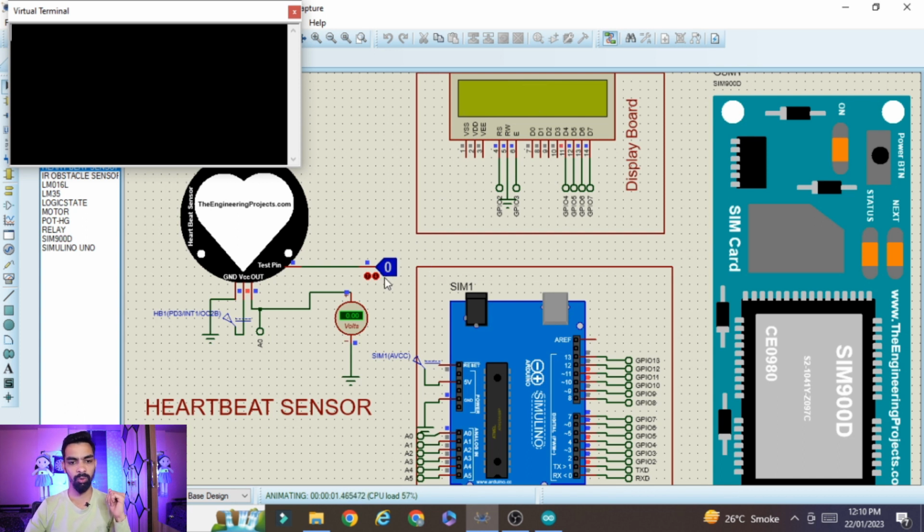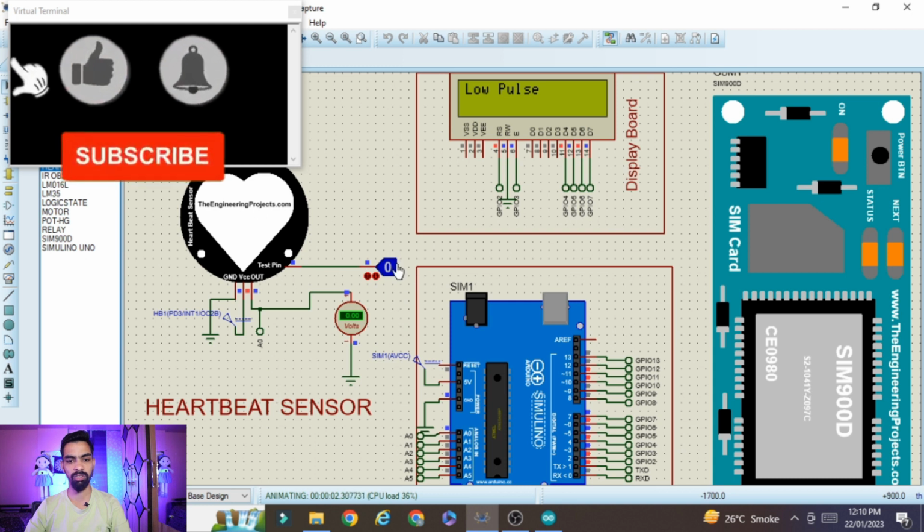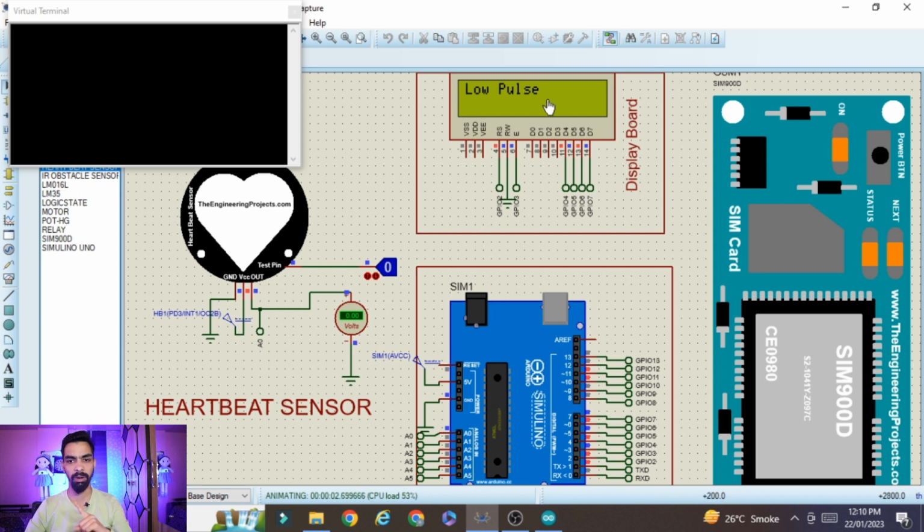So what we have to do, just give the high signal first here. So high pulse is detected. Now I will deselect this, so I will set logic 0. So every time it will show the low pulse right now because pulse is not seen. So you can see only one pulse is detected by the Arduino.